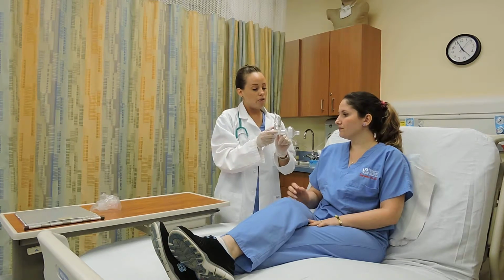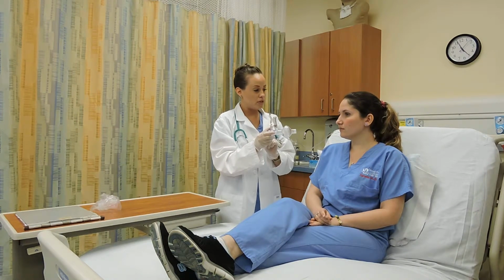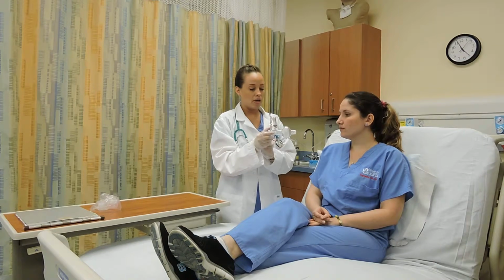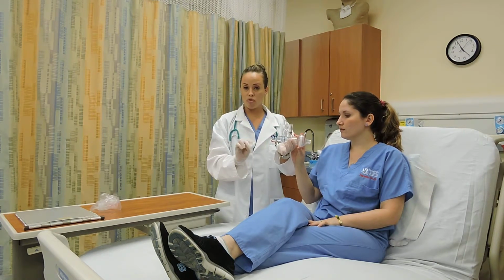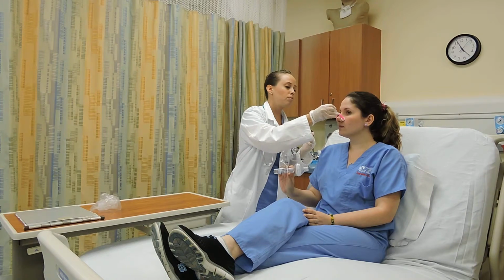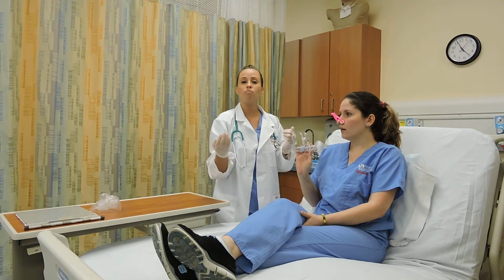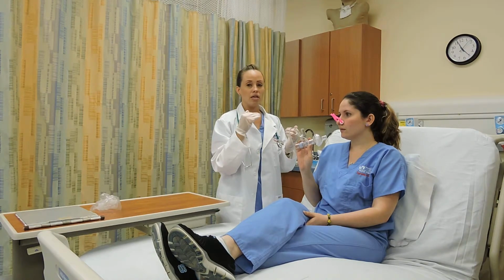All right? Very important to know that the exhalation has to be active but not forceful, and also try to make it last 3 times longer than inhalation. Okay? Then you're going to do 10 to 20 breaths followed by 2 to 3 half coughs to clear out those loosened secretions. Okay? I'm going to place this clip on your nose. This might feel a little bit uncomfortable. It won't hurt you. It's just to make sure that the air is coming out through her mouth and nothing is leaking out of her nose.